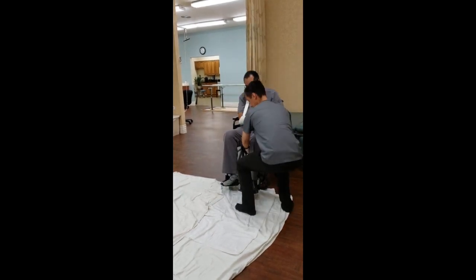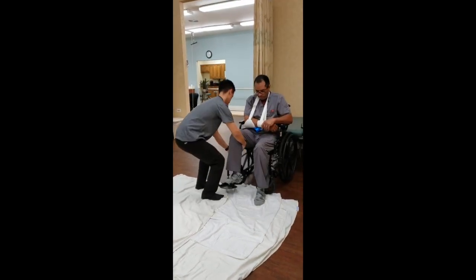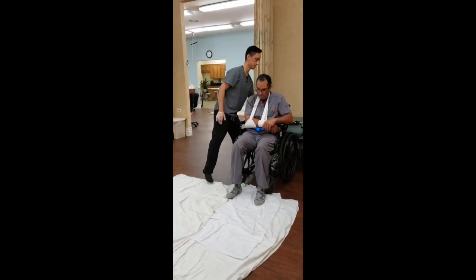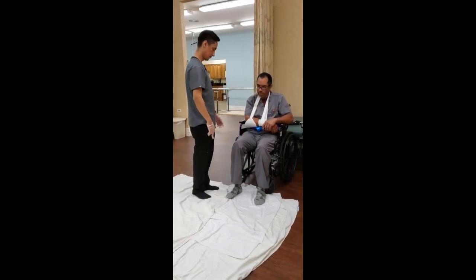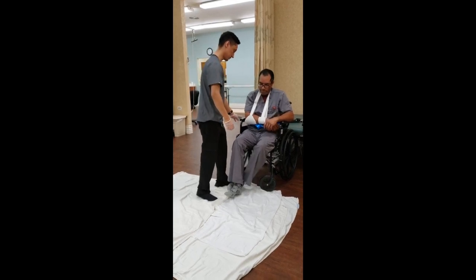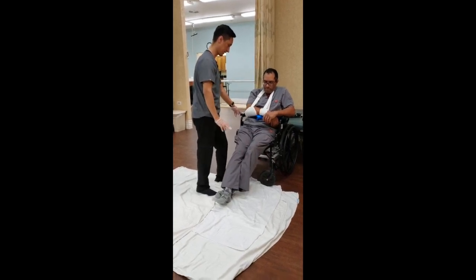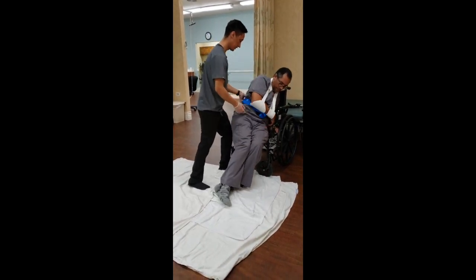Make sure that you remove the leg rest. And make sure that you stand on the weak side, in this case the right side. So first thing we're going to do, I'm going to have you scoot forward using your strong side. Put that leg out. I'm going to have you roll all the way into your tummy.